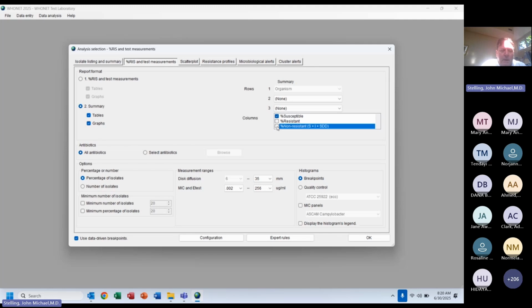That's one change. There's another change we did introduce maybe 2 months ago where, well, I'll talk about that later, but you can say 30 isolates, 40 isolates. I'm going to come back to that. I'm going to do a simple antibiogram, percent susceptible. I can choose the antibiotics that I want for my antibiogram. I'll come back to those options later. I just want susceptible, percent susceptible. Okay.